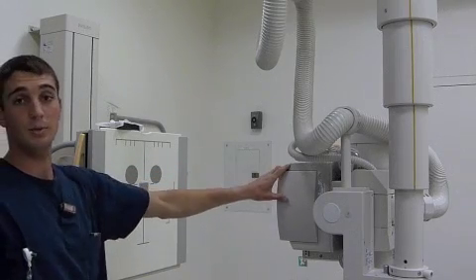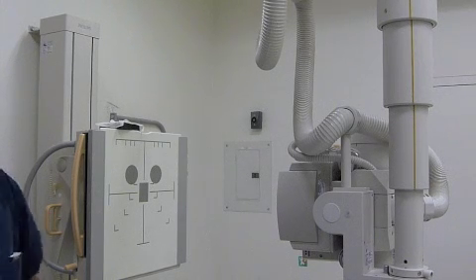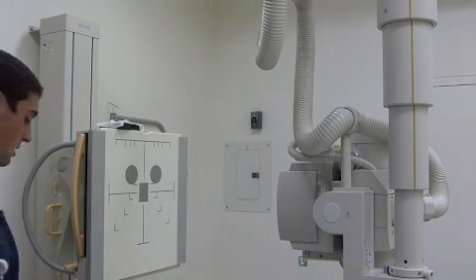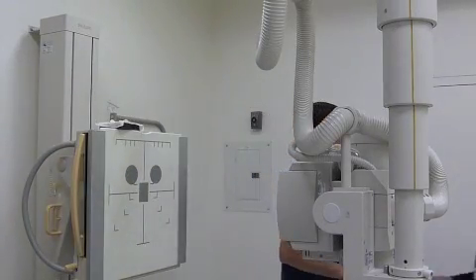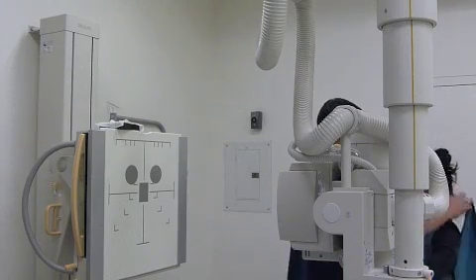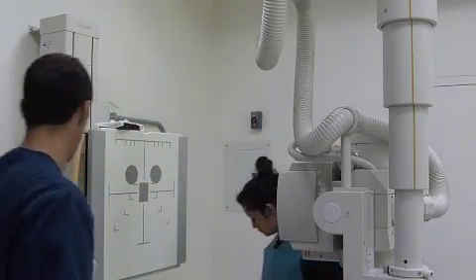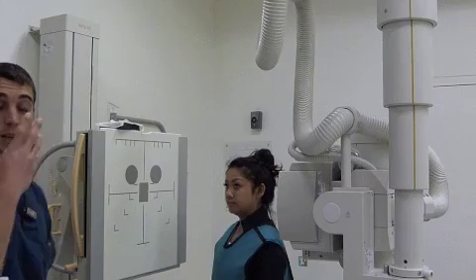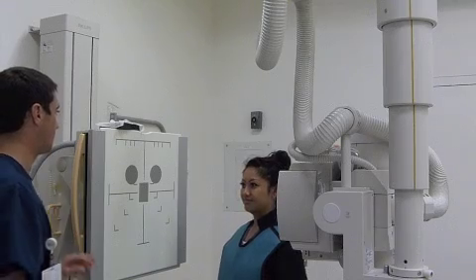I already have my tube set at 40 inches with a perpendicular angle to the IR. I will now shield my patient. Come on over here. And I made sure the patient took out any hardware, earrings or necklace or anything they have on.